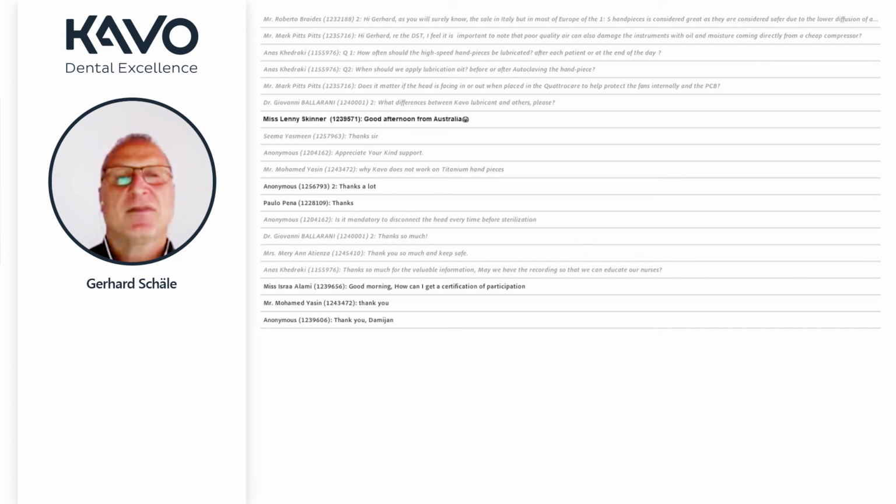We should not have oil in the driving air, but this is a question of really old compressors or cheap compressors. Here it must be 100% safe that we do not have moisture directly coming through the driving air channel, because this is produced in the compressor. And of course, we should always talk about dry driving air. That's important.